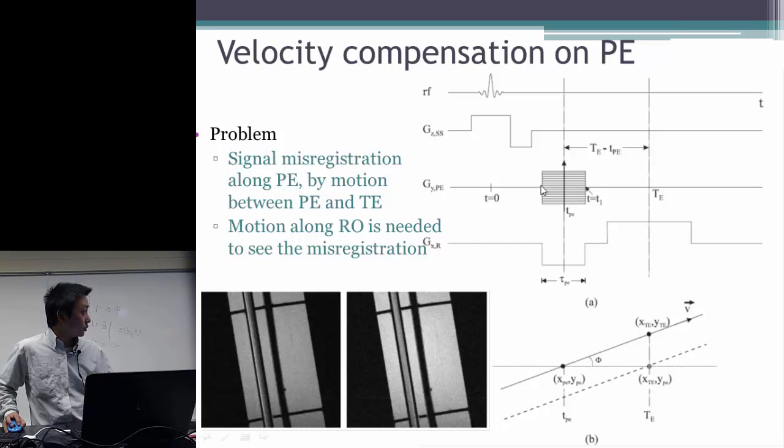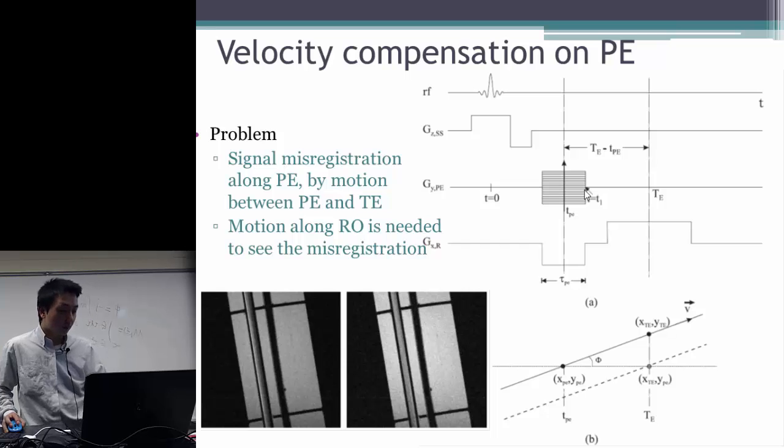We usually just keep a constant time of the phase encoding gradients, but we vary the amplitude of the phase encoding gradients to achieve a certain zeroth gradient moment for the different phase encoding steps. This means we perform this phase encoding before the readout of the signal.